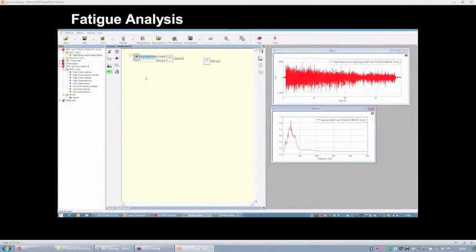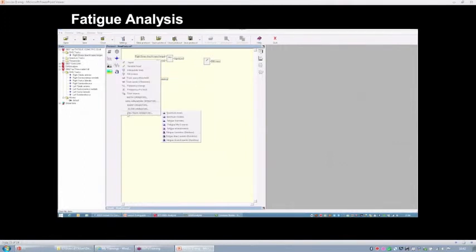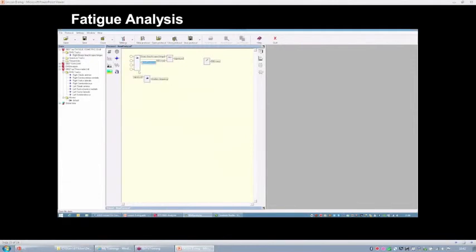So now we can, for example, compute the median frequency. And as you can see, it is around 50 Hertz, so 52 Hertz. So it's lower. The median frequency of this spectrum is lower with respect to what you have in a typical unfatigued EMG spectrum.